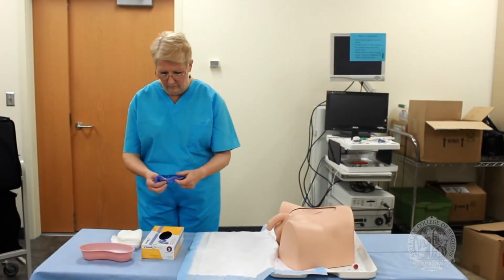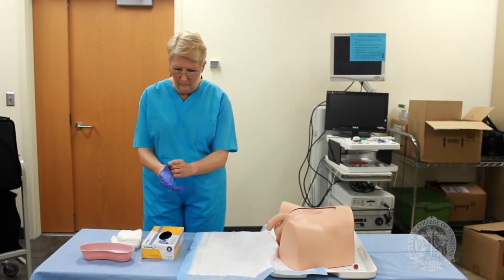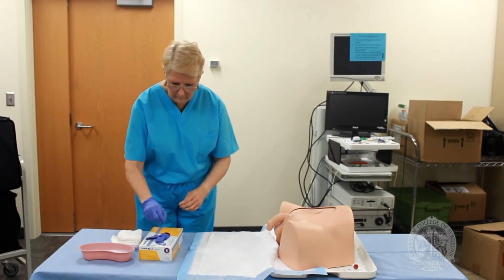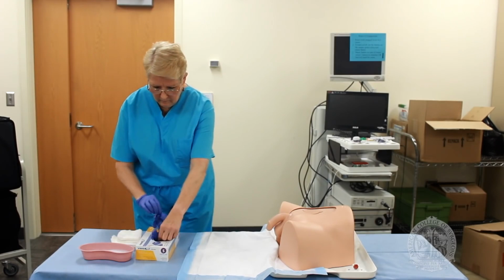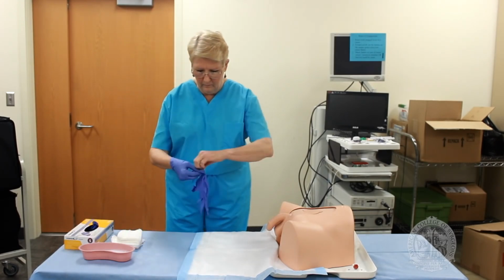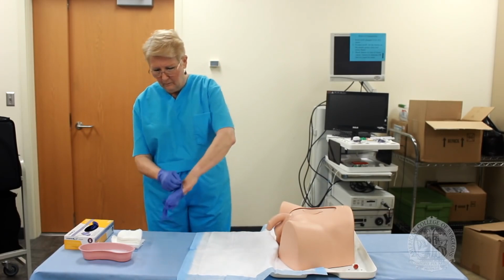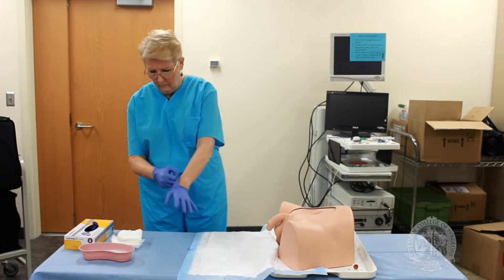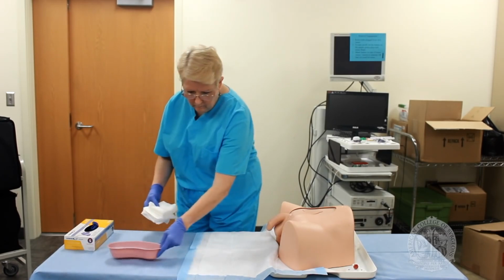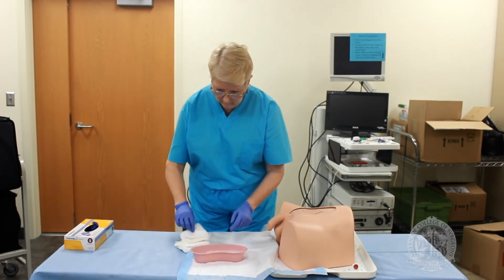In this video, we will be focusing on placement in a patient with a penis. Positioning is key for this procedure. Place the patient in the supine position with their legs extended. Place a waterproof or absorbent pad under their buttocks and upper legs. Ensure privacy for the patient. Pull the curtain and expose only the necessary parts of the body.